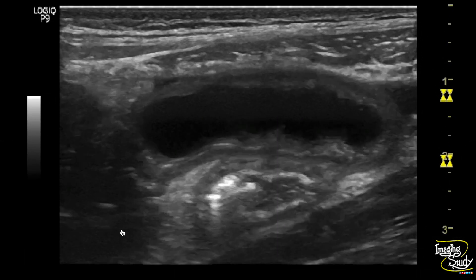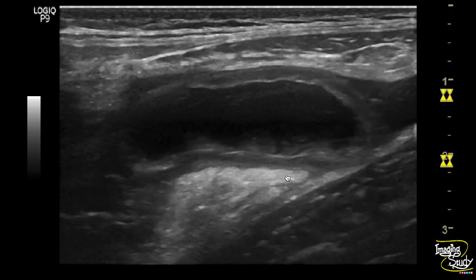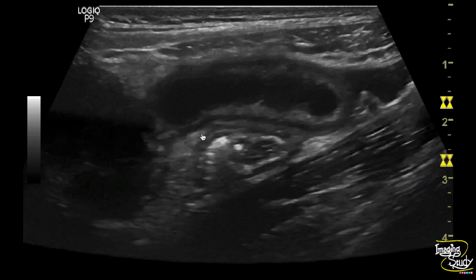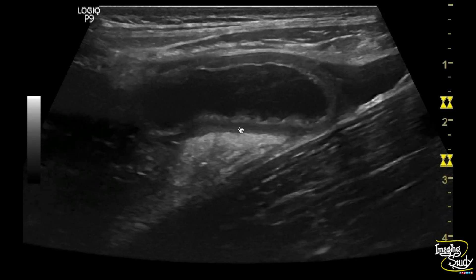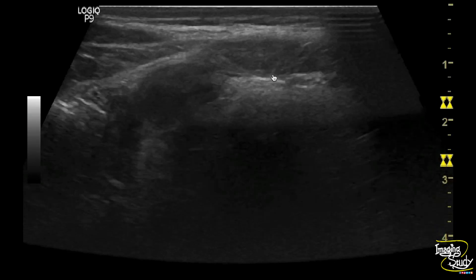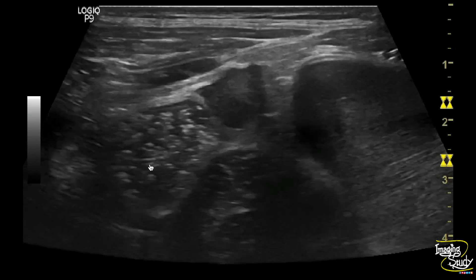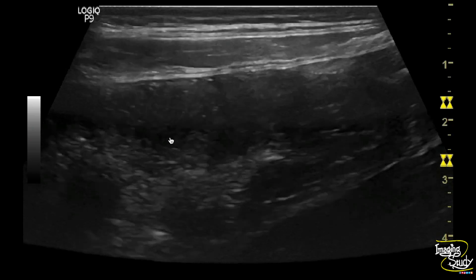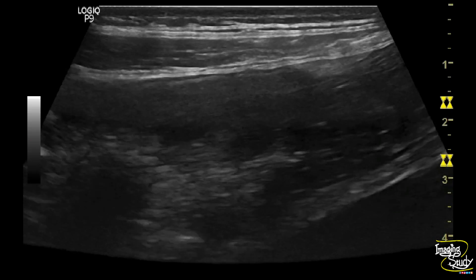Here you can see the longitudinal section of the right iliac fossa. You can see a blind-ended, fluid-filled, distended structure of intestinal origin connected to the adjacent cecum. This is the cecum.